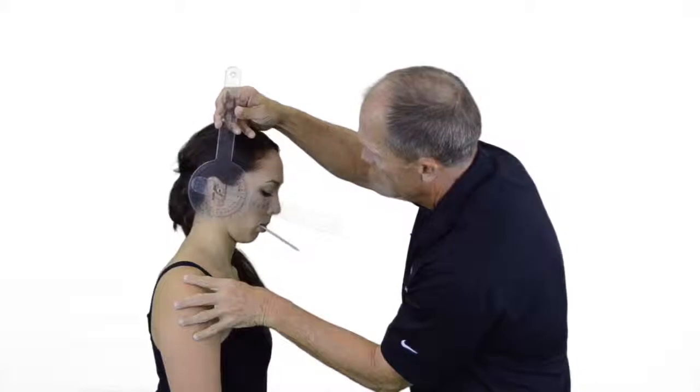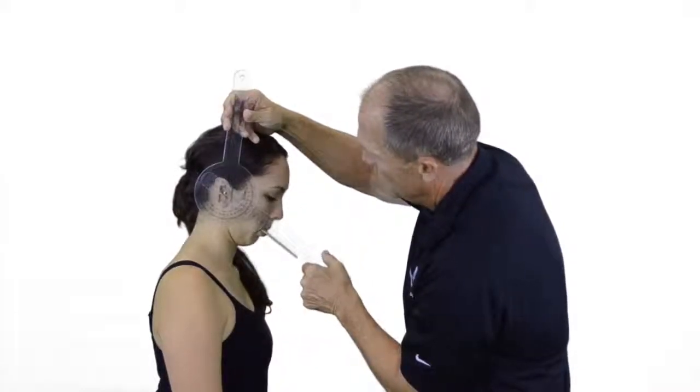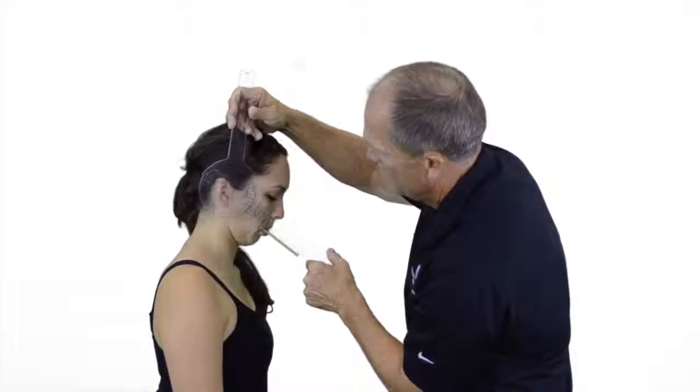As the patient flexes forward in that position, we would again parallel the measurement to the tongue depressor. This gives you assistance in your alignment for cervical spine flexion.